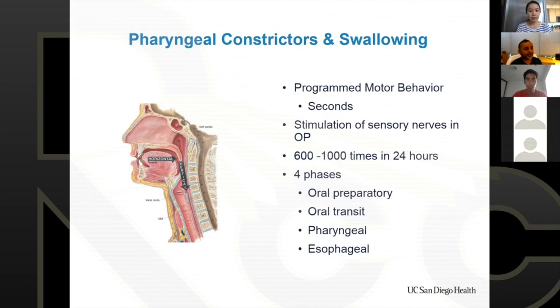The other question I get, which the patients love to ask, is, hey, can you move that submandibular gland back? We've generally not done that. It's kind of an ordeal to do that. There's a little bit of submental fullness that they will get because the gland usually goes right here in these patients.